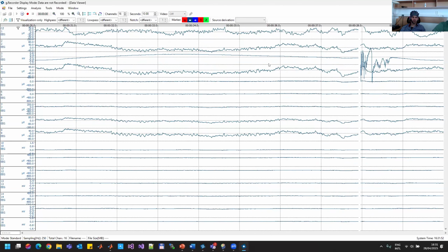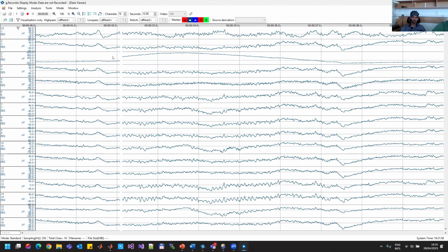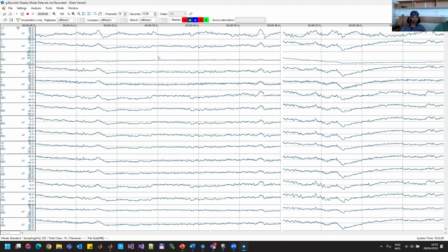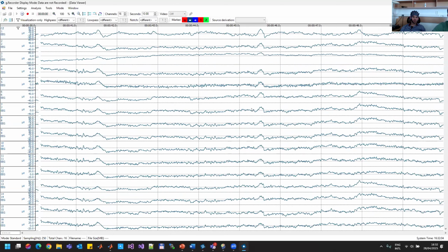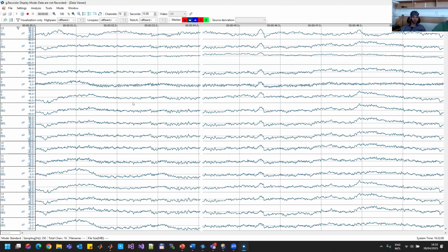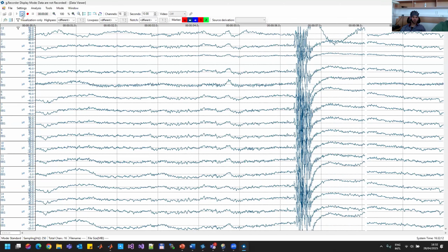It's a very easy way to investigate signals only by looking at them. Of course, we can check the impedance and so on, but that's a different story. So from my point of view, the signal looks very nice. Okay, so I will stop it for the moment.